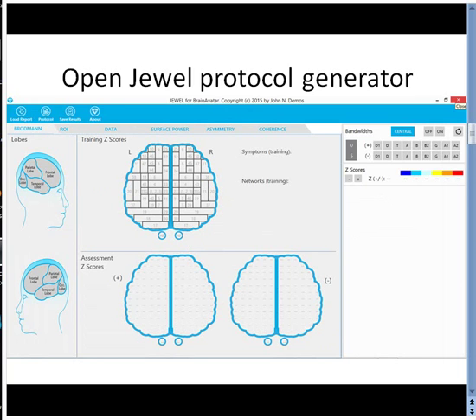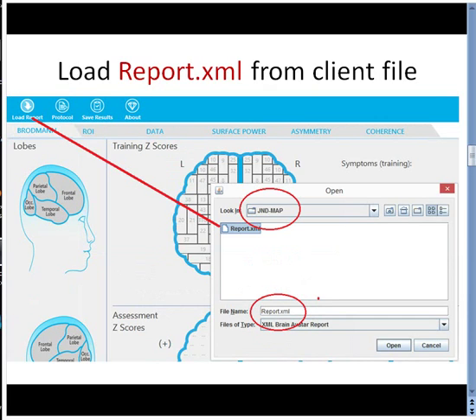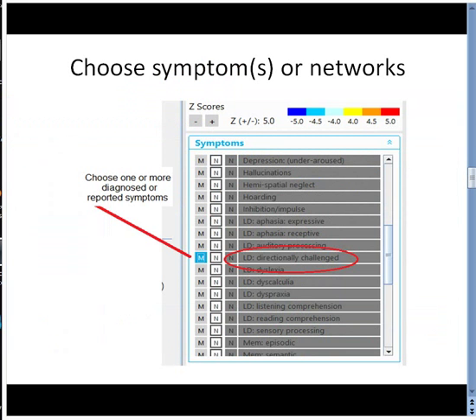Fourth, we open up Jewel for Brain Avatar. Next, we load the report XML file from the client folder. Sixth, we need to choose a symptom or network of interest, and we click M for match.